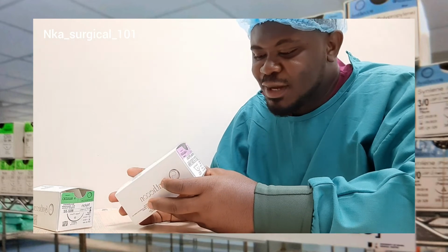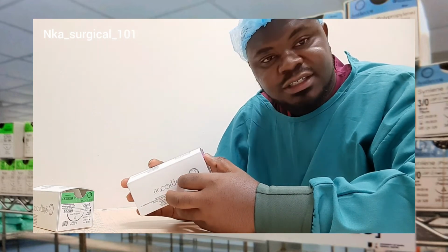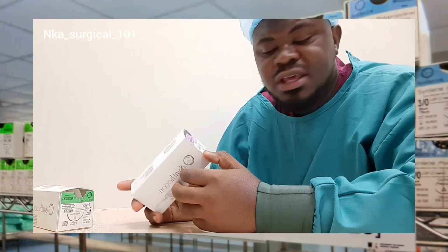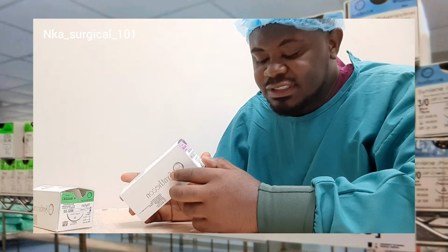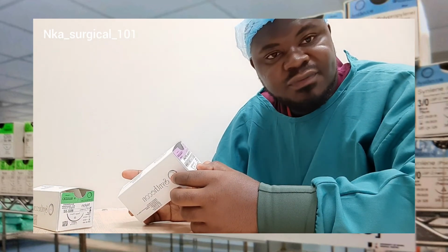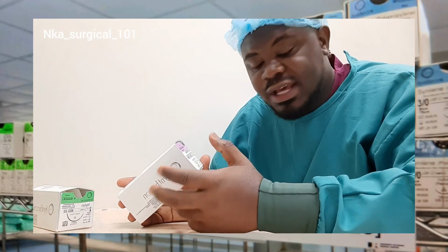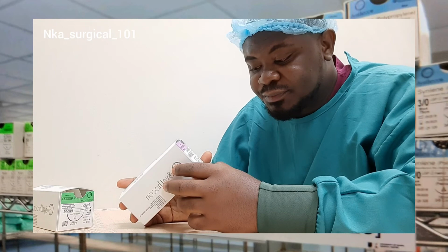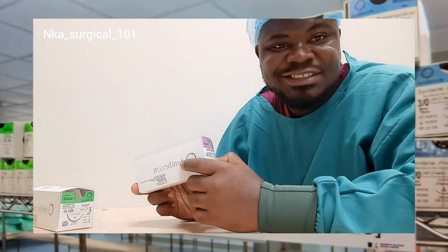Surgical sutures come with various specifications, and in some of the upcoming videos I'll take my time to explain a lot of the things that we need to know about surgical sutures, like the size of the suture, the color of the suture, whether it's round bodied or whether it's cutting, the length of the suture, and a lot more.